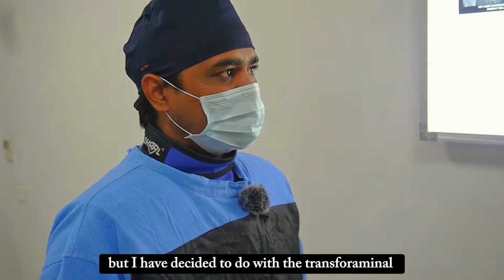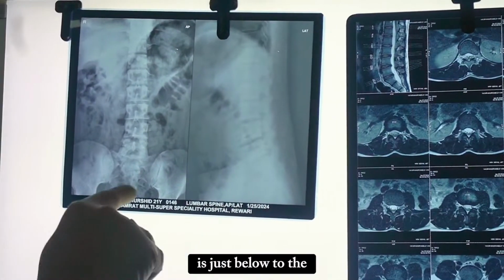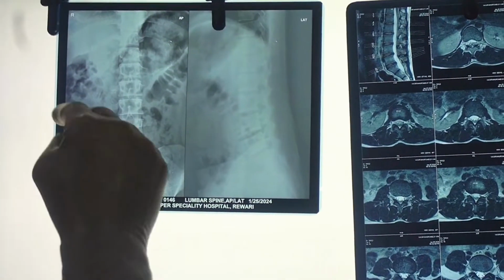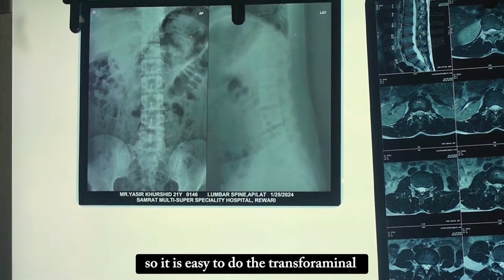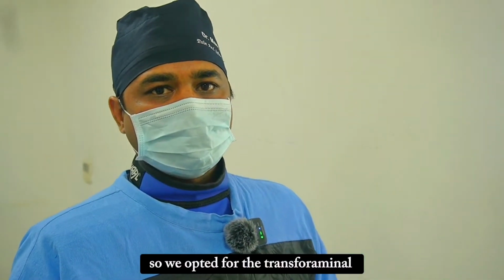Although it is L5S1 level, I have decided to do it with the transforaminal approach because the height of the iliac crest is just below the pedicular line, so it is easy to do the transforaminal. So we opted for the transforaminal.